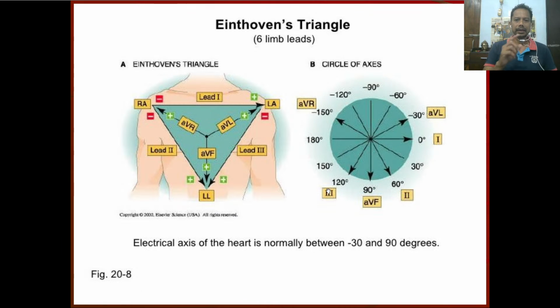It is very important to know that there is a positive pole and a negative pole of each lead. And please remind me when 1 hour is over, because my lecture sometimes goes very long and then it becomes boring. So at 1 hour please message me in the comments box, sir, 1 hour is over, and I'll continue in the next hour.